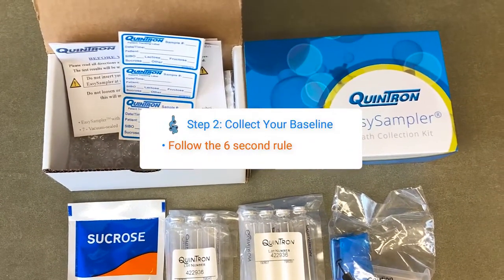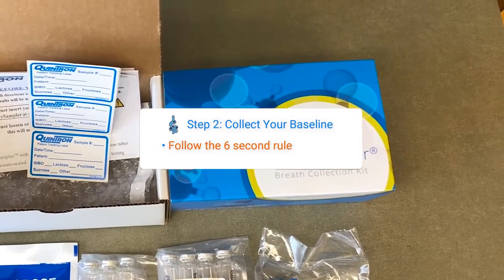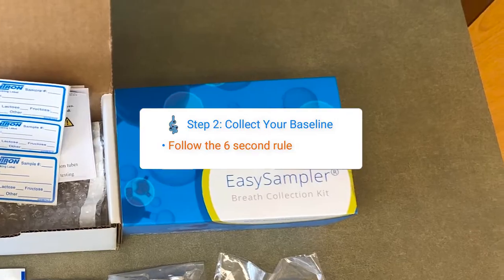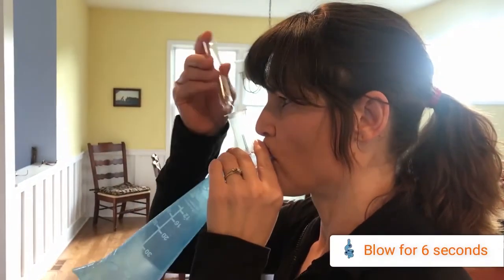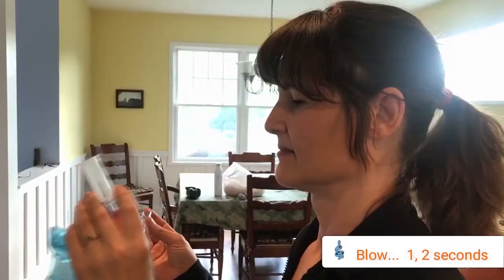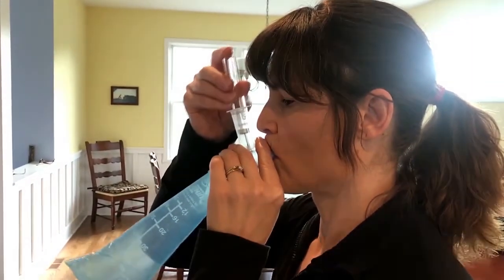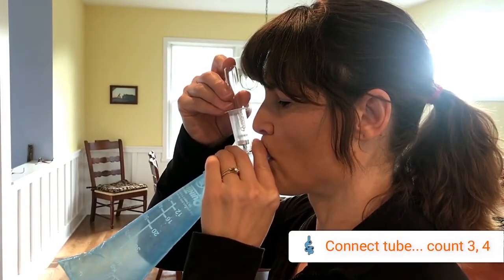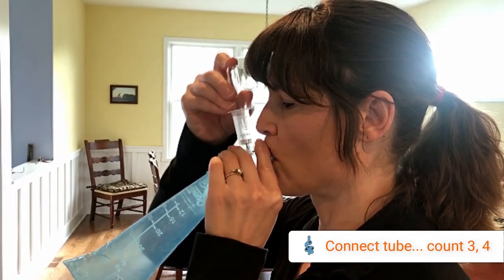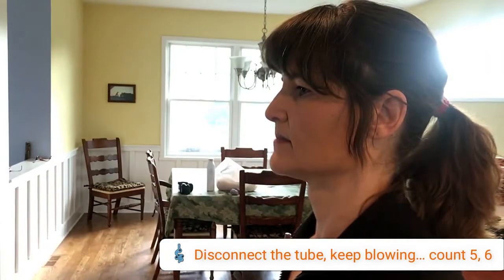Collect your baseline sample by breathing into the Quintron Easy Sampler. Follow our 6-second rule to ensure a proper collection. Blow into your Easy Sampler for 6 consecutive seconds while collecting your breath specimen. Start by blowing for 1–2 seconds into the Easy Sampler bag. Press the collection tube into the tube holder hard enough to break the rubber seal with the tube holder's needle, and count 3–4 seconds. Remove the tube from the tube holder while still breathing and count 5–6. Now you are done.